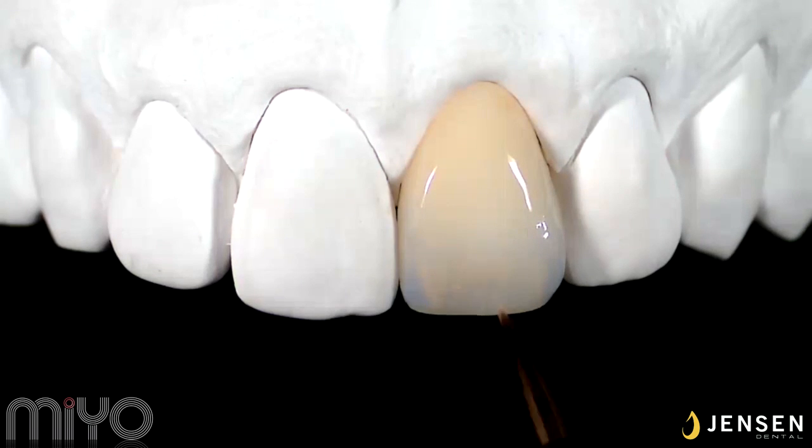My halo effect is applied using halo spring in the MiYO system. To give you guys a small tip, halo usually follows the shape of the mamelons and wraps around the interproximal region. Dab and float the color to create the halo effect.